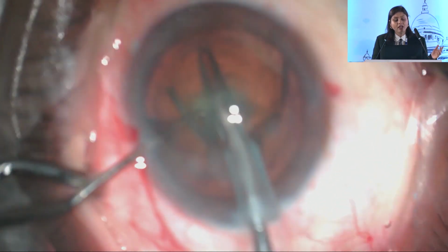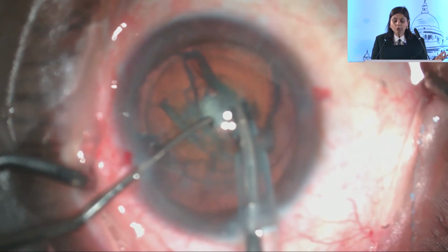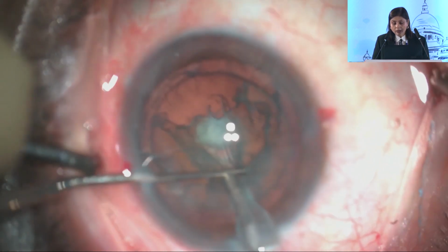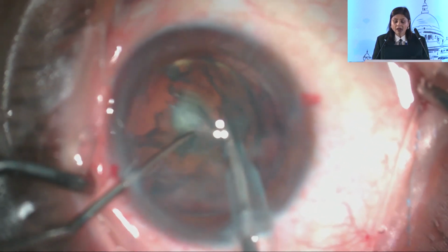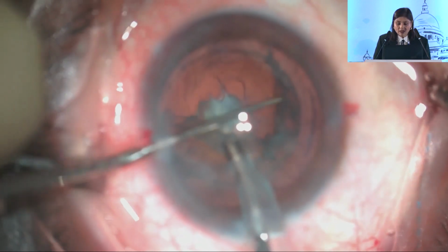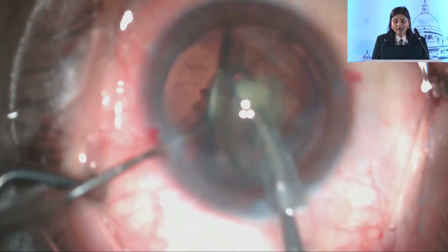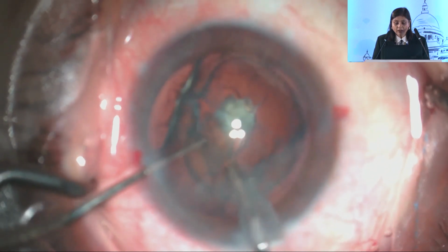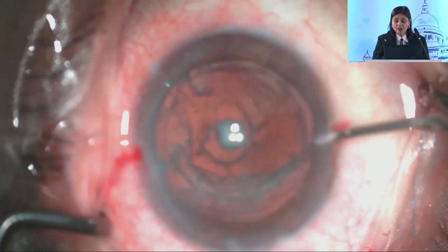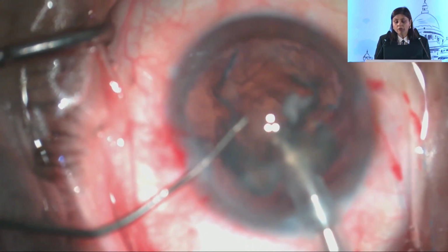So we are going ahead with our standard technique, and this is again a soft cataract, as most of these tend to be since they present early in posterior polar cataract. We are again taking all the precautions here, not aggressively rotating the nucleus, keeping the settings low, and proceeding with phacoemulsification as we would do in all patients with posterior polar cataract. Till now everything seems to look good, and I have emulsified the nucleus, and no inadvertent event has happened. Notice that we are keeping the chamber stable. I have injected dispersive OVD from the side port before removing the infusion cannula.